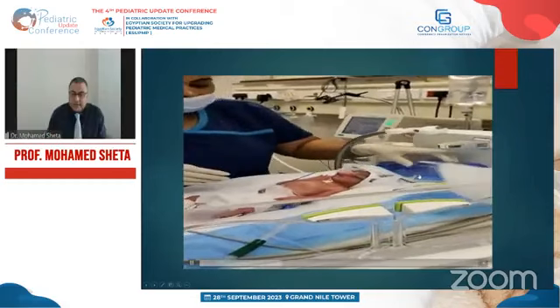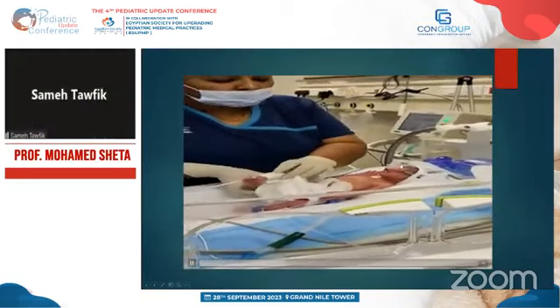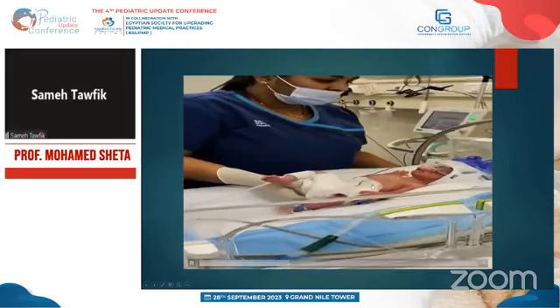So there is our ambo bag as a rescue. The baby is in CPAP. He has severe respiratory distress.